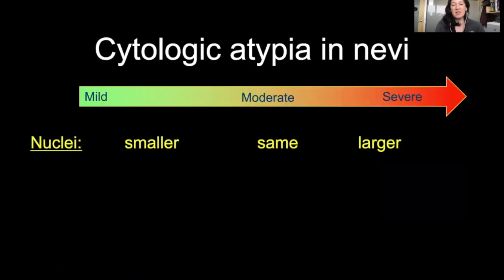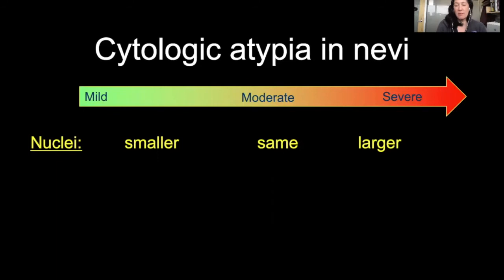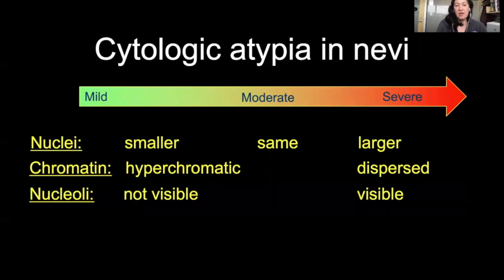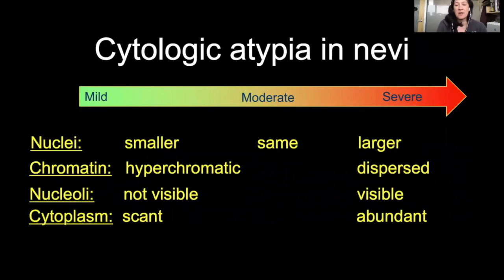Cytologic atypia: we can rate the degree of atypia based on nuclear size, with more severely atypical melanocytes having larger nuclei and more dispersed chromatin, and visible nucleoli — with the classic descriptor that melanoma has cherry red nucleoli. In more severely atypical melanocytic proliferations, there's more abundant cytoplasm versus scant.